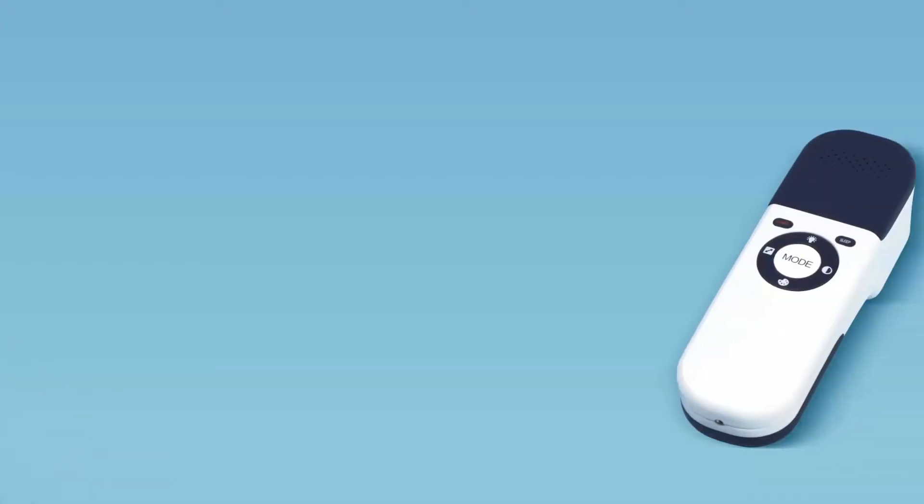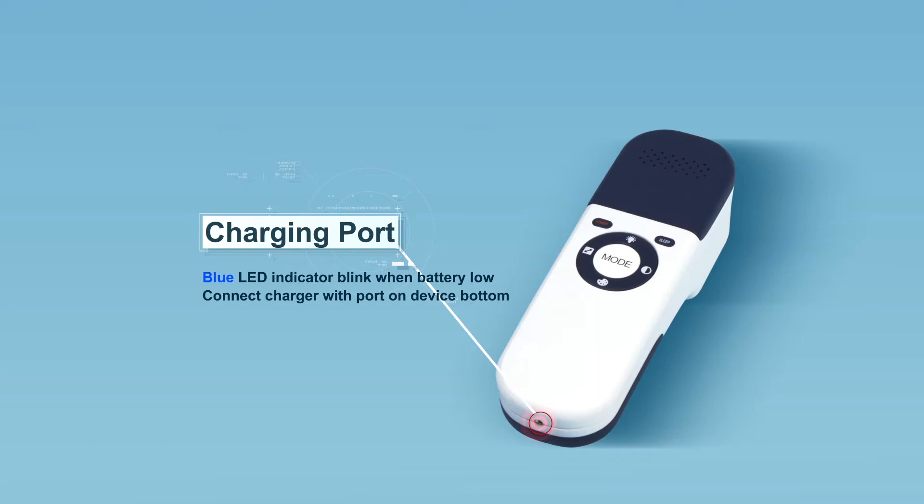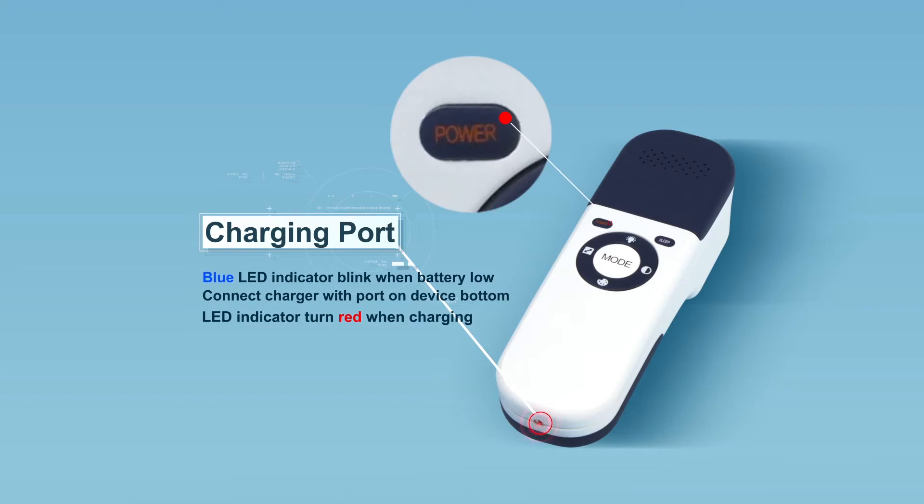The blue LED indicator on the power button will blink when the battery is low. To charge the VeinFinder, connect the charger to AC power and insert the charging cable into the port on the device. The indicator will then turn red.